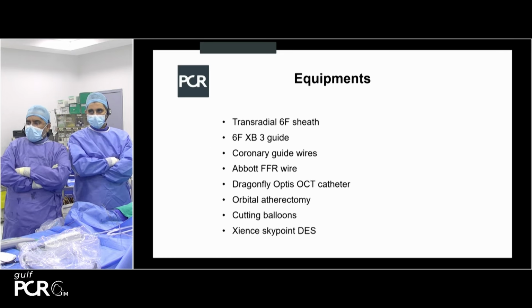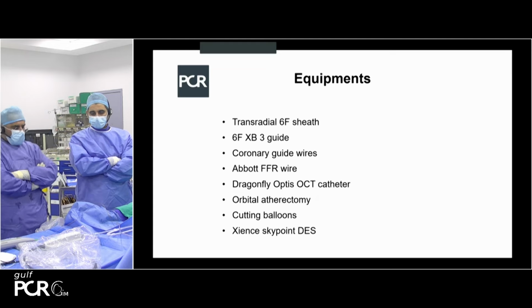And the equipment we're going to use, as you can see it on the screen, I'm not going to go over them. And then I'm going to hand over to Dr. Abdallah to tell you where we are at the moment.